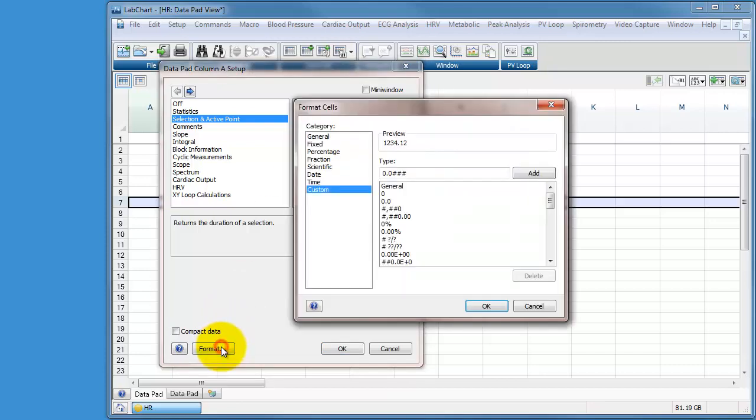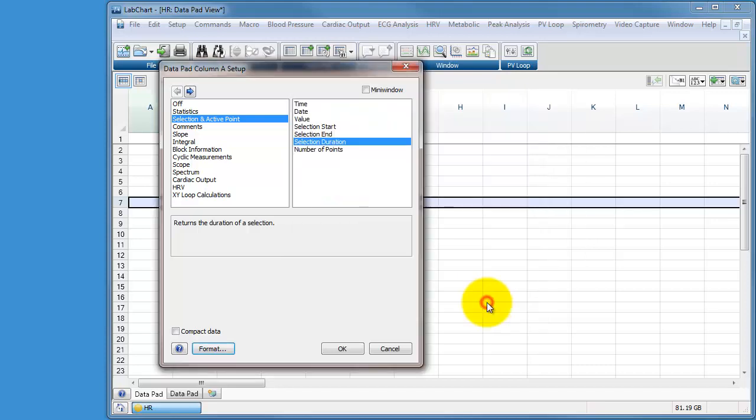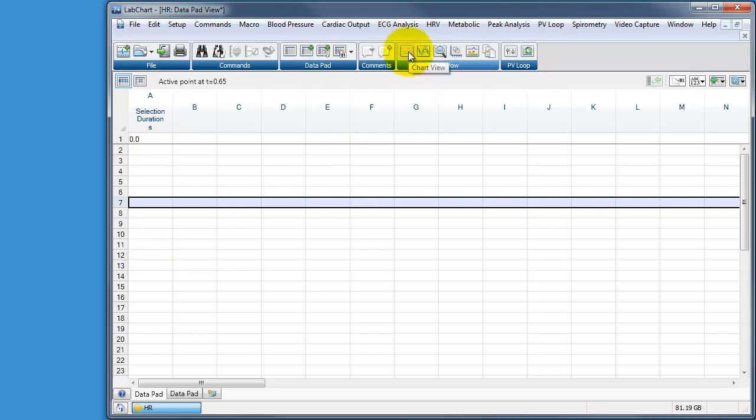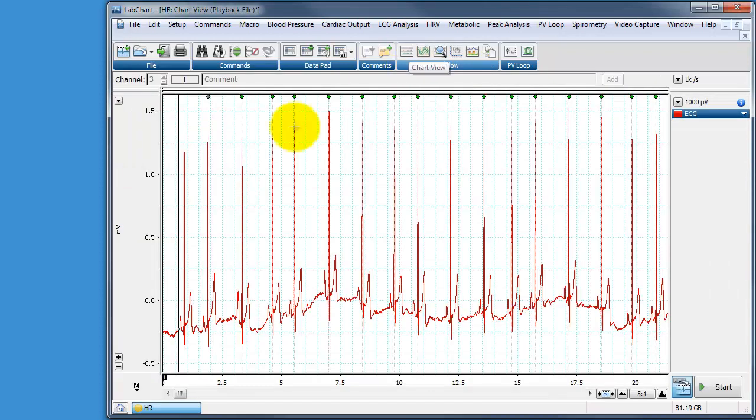I can format that and make sure it's in seconds. Let's say two decimal places is fine with me. Press OK. And now it's going to give us the duration of each of our R waves. So we go back to our chart view.